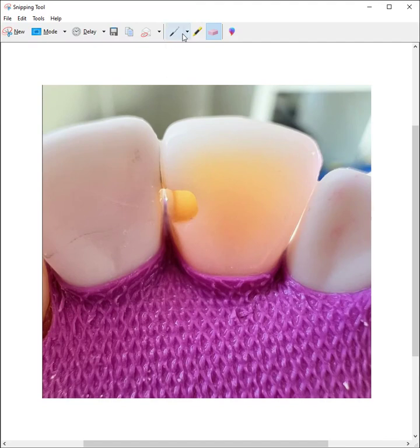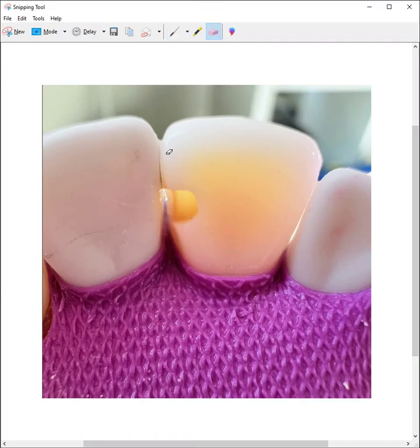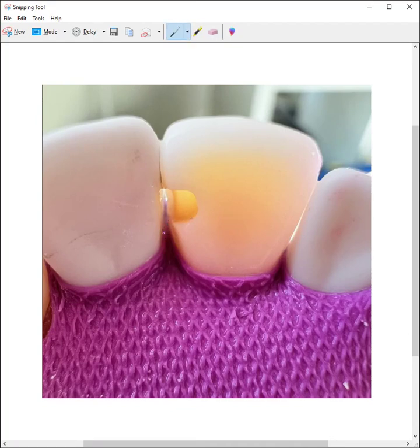Your dimensions from incisogingivally this way are good. You can go up to three if you need to. You don't have to. And then you've broken contact on the gingival, about one millimeter right here. So that's good.